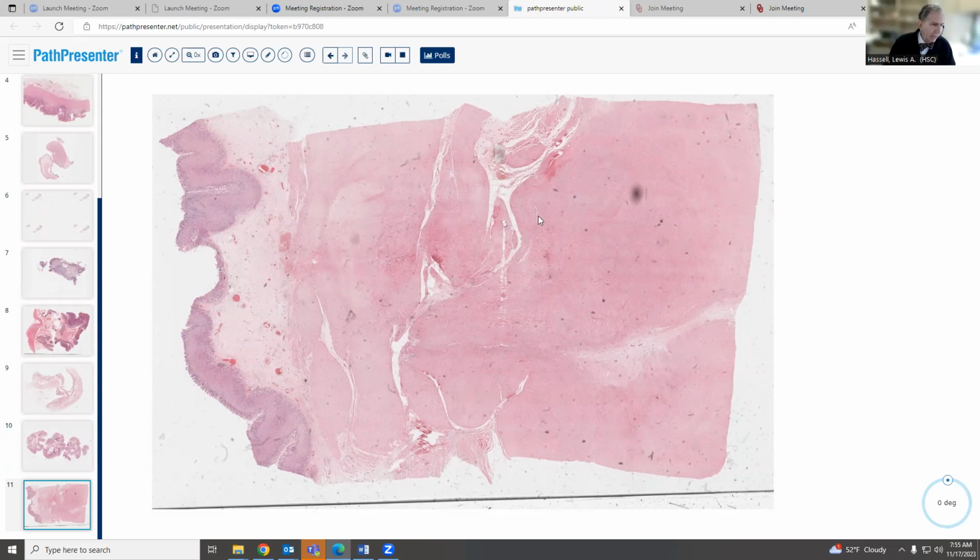Walid, very good. Thank you for bringing these bread and butter cases. We all need to see examples, and there's great value in that as well. We had a good question from Mark about how to differentiate collagenous colitis or gastritis or whatever from just an aberration of tangential sectioning. So what clues do you use in that setting to guide that?